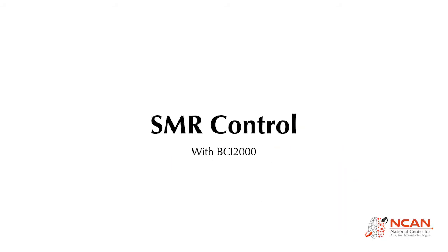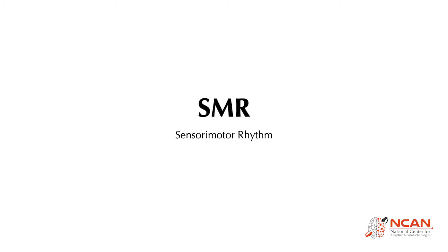Hello, and welcome to the SMR control tutorial with BCI2000. SMR stands for sensory motor rhythm. Before talking about the control experiment, we will first walk through some key concepts of SMR.